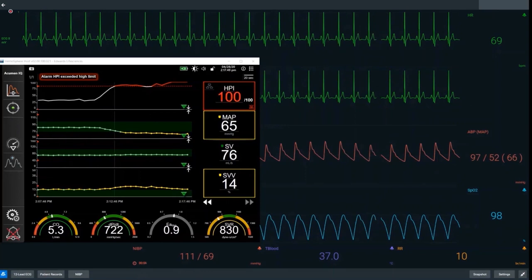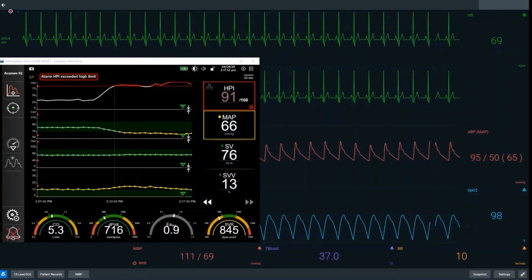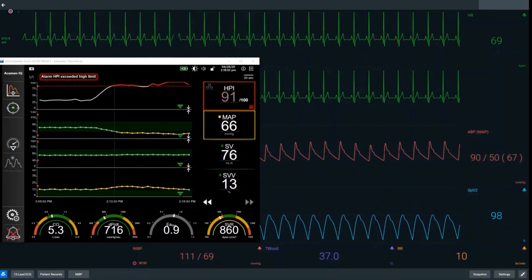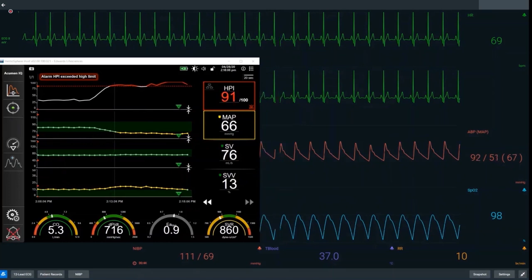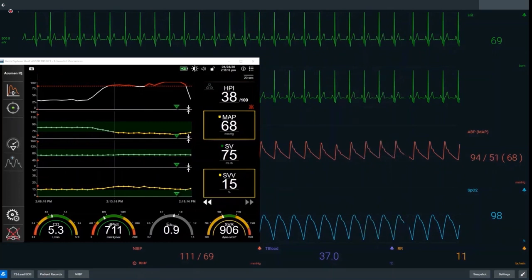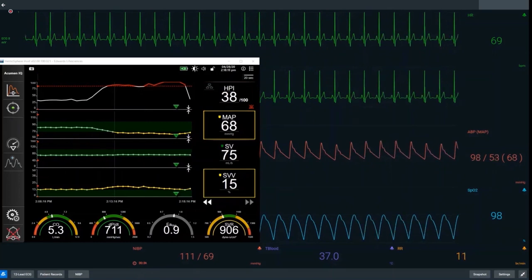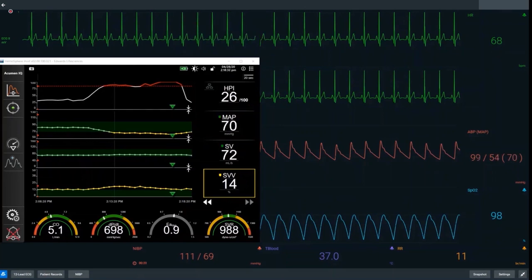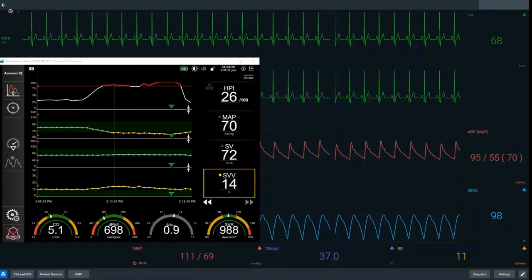Once the vasopressor is given — denoted by the green arrow on screen — we see almost instantaneous changes in both HPI and mean arterial pressure. HPI drops at a relatively rapid rate as the underlying vasoplegia is corrected by the vasopressor. We want to see it drop down to normalised values, such as 38. Blood pressure also starts to increase; mean arterial pressure has gone up from 64 to 68 and we want to see that continue to increase.